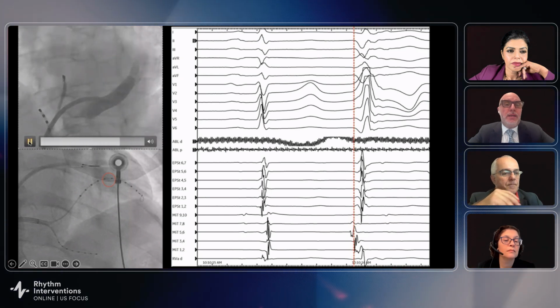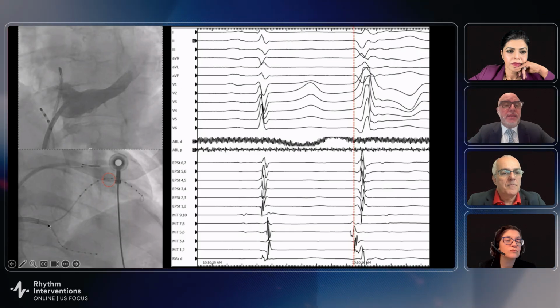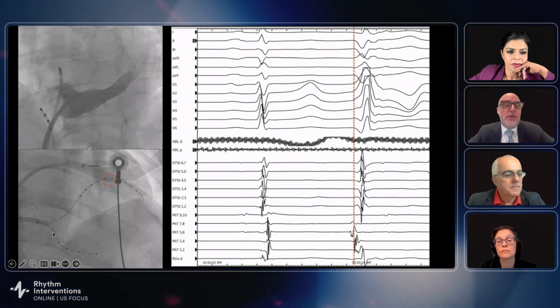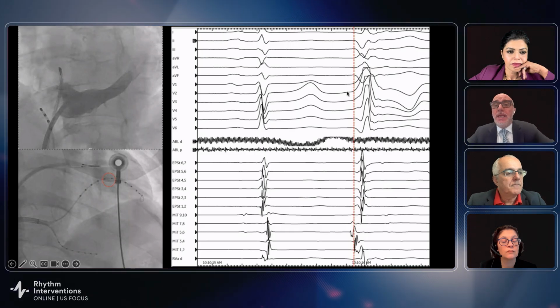You can see briefly, there's a lateral branch coming here. And then nicely, in the same Agilis, you can put a 4 French catheter. With one sheath, I can put 2 catheters into my veins. So I directed that to remove the 4 French here, and I placed an EP catheter in the middle cardiac vein.